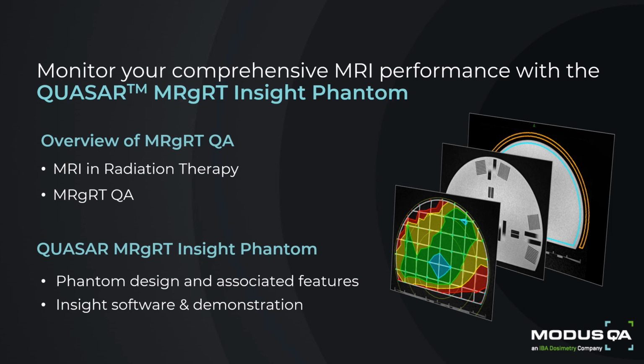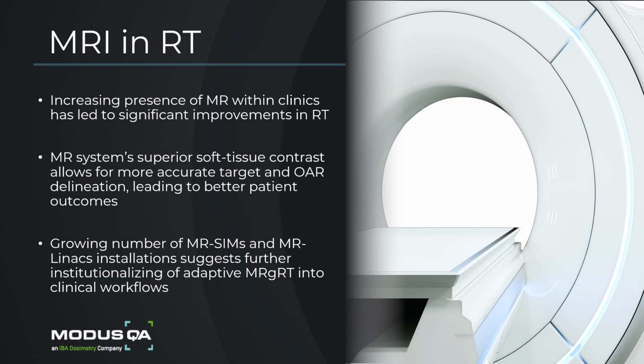Thereafter, we will dive into our automated software platforms, which work in tandem with the phantom to provide fast and efficient, but still high-quality performance metrics about your MRI system. Lastly, we will conclude our time together today with a demonstration of this software suite so you can see firsthand its functionality. And so, let's begin.